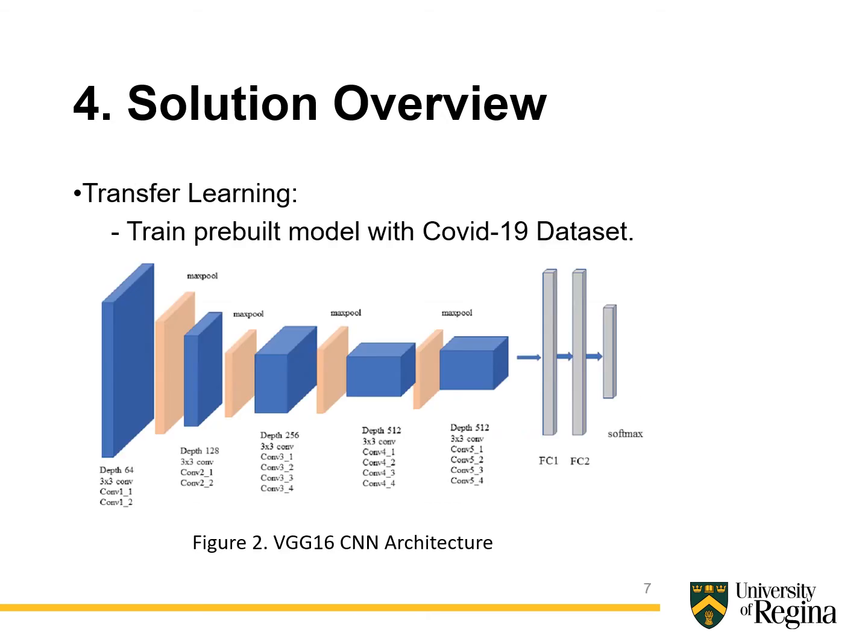The deep learning models, especially the convolutional neural network models, need a high computational cost to train. The concept of transfer learning helps reduce this effect by enabling the users to customize the pre-built models, which helps in reducing the training time and faster convergence. The pre-built models like VGG16, as shown in the figure, are a good starting point to initialize the network parameters rather than explicitly training a model with random parameter initializers.